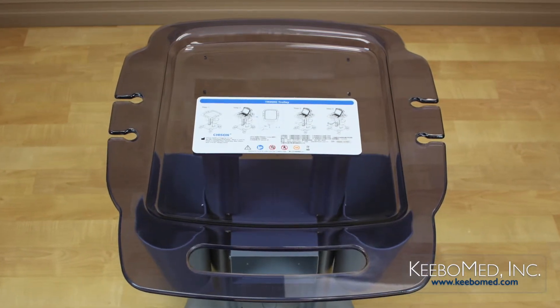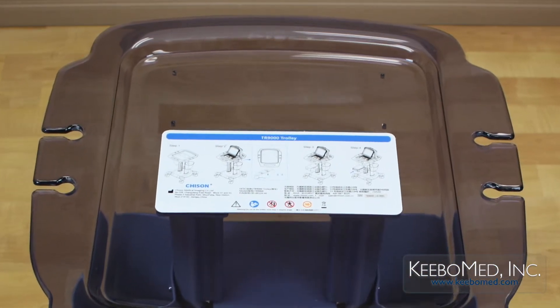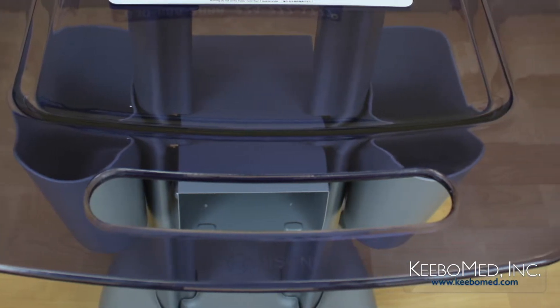The two probe holders on each side provide much convenience and flexibility in use. A sturdy handle allows the trolley to be easily moved.